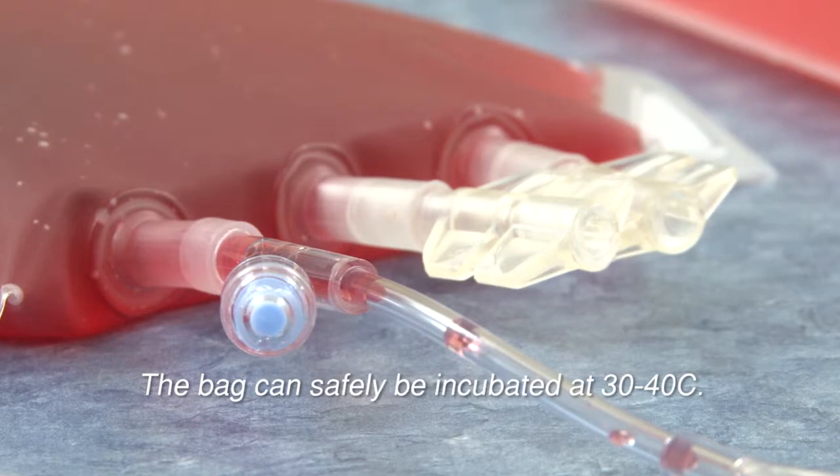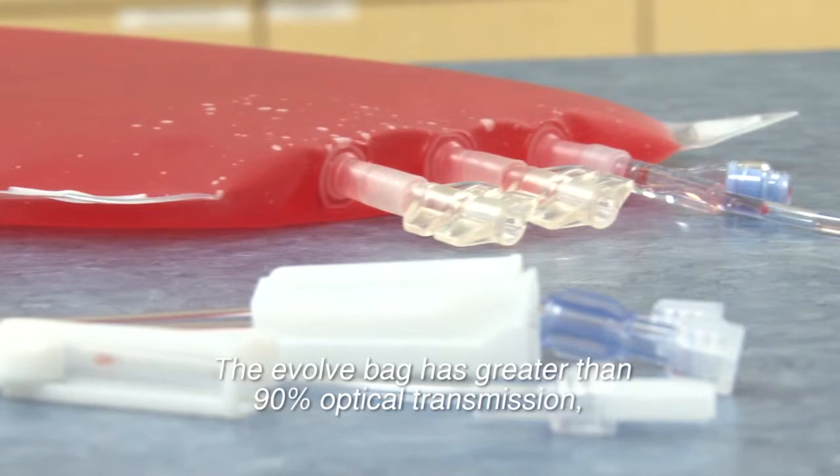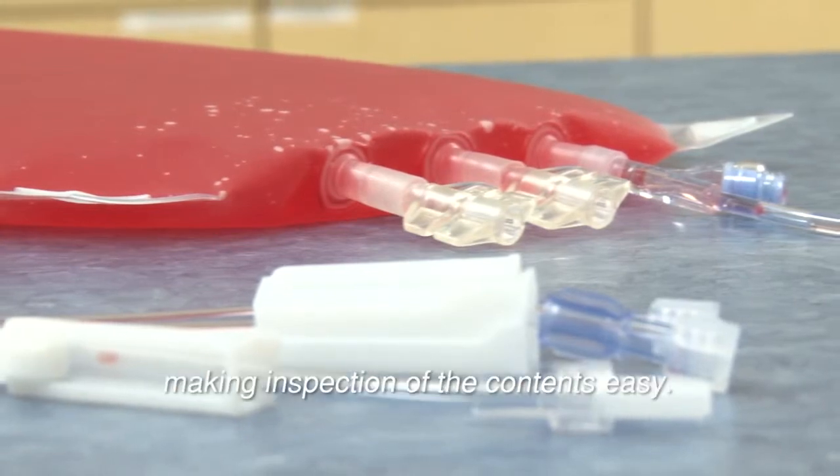The bag can safely be incubated at 30 to 40 degrees Celsius. The Evolve bag has greater than 90% optical transmission, making inspection of the contents easy.